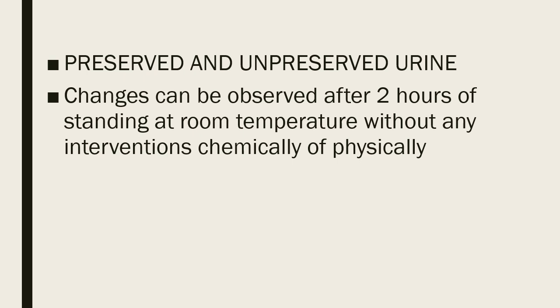And so that is why most laboratories require the urine sample to be submitted within 1 hour after collection. And of course, the remaining 1 hour will be utilized for testing.